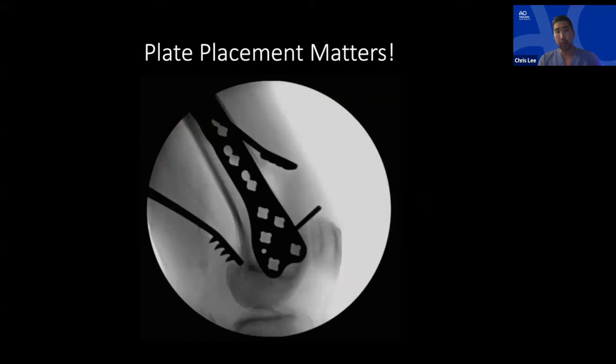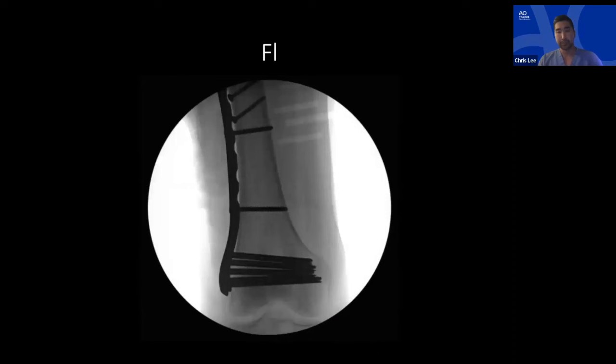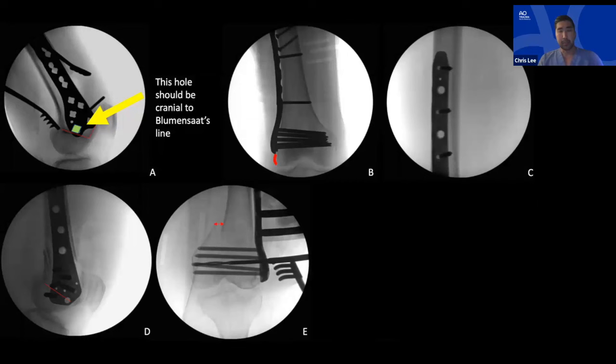On the lateral view I look for the trochlear groove anteriorly and Blumensaat's line posteriorly, wanting the posterior distal condyle contained within Blumensaat's line. This ensures proper plate position and avoids in-out screws and notch penetration. The shaft of the plate should sit on the anterior one-third of the femoral cortex on lateral view. Those distal screws should be tilted 10 degrees anterior-to-posterior, matching the articular block tilt — failing to do this causes external rotation of the articular block.